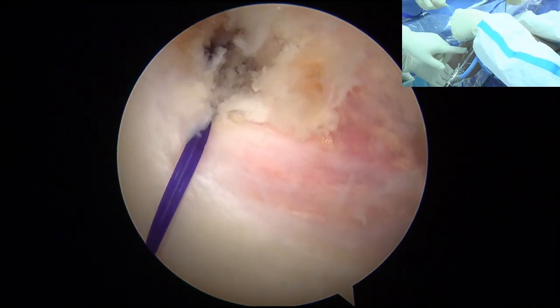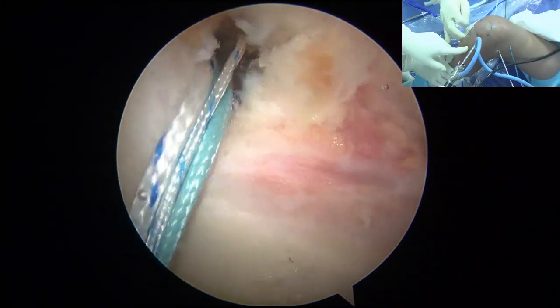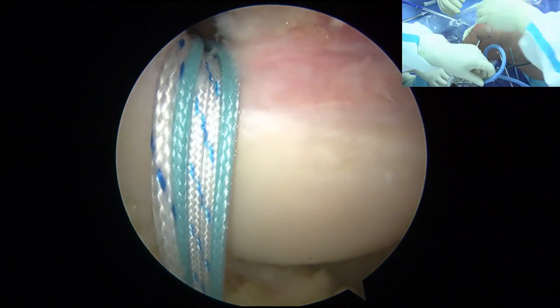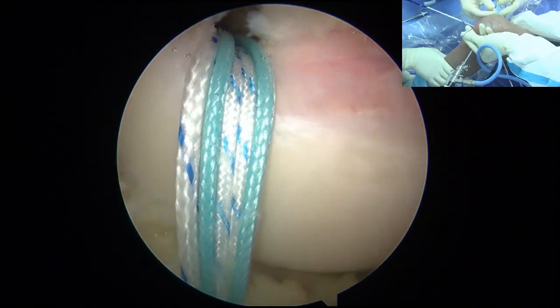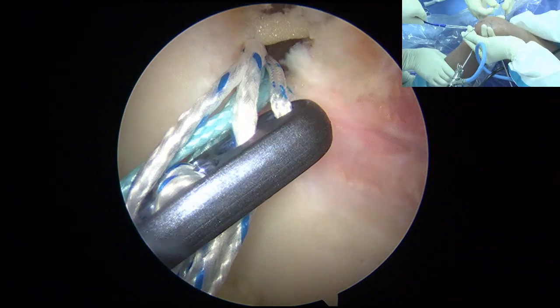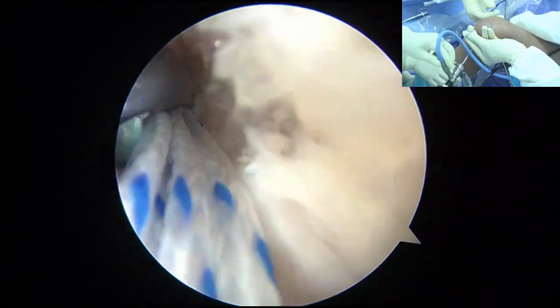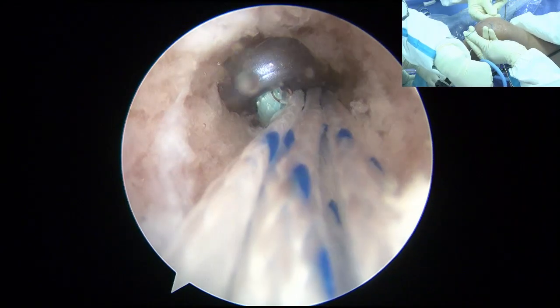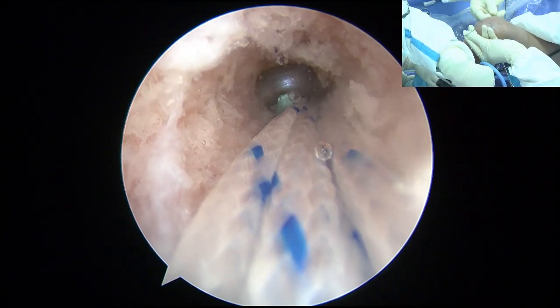Okay, go, very good. Pull, pull, pull, very good. Pull in. Okay, and now look for the button coming. 好，注意看胎板即将进入镜头。Pulling in, you see button coming. Very good. 看到了. Going. Going. Now you follow this button. 继续镜头对准胎板. Follow slowly. Go.